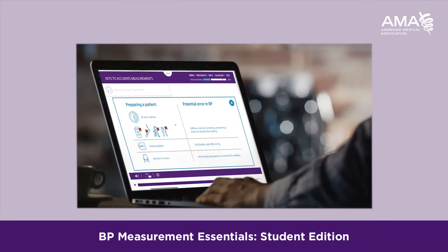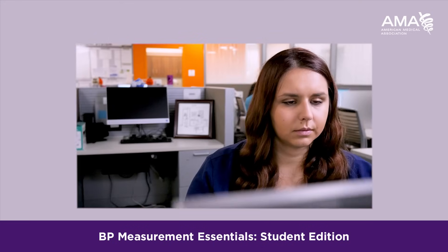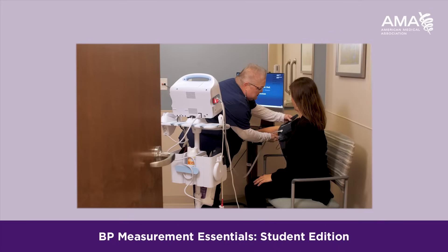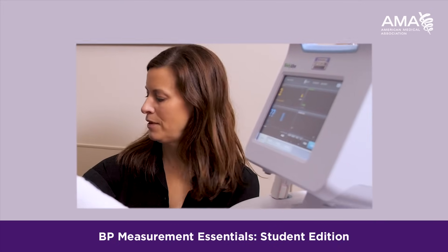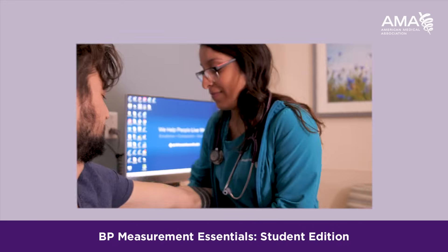This module is a really good introduction, but also an opportunity for students to review their skills and teach their patients how to measure their own blood pressure accurately. If it's not done properly, that could lead to over-treatment or under-treatment.